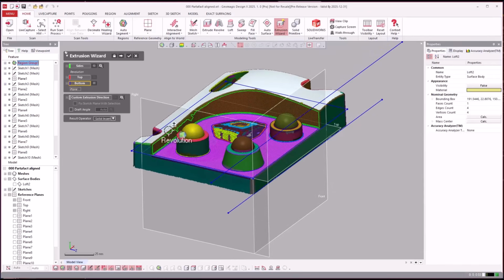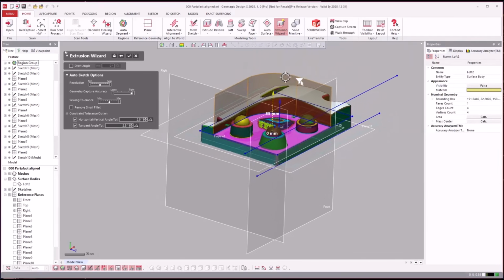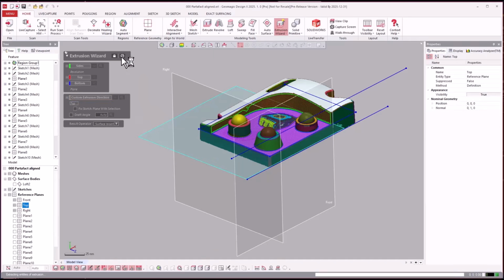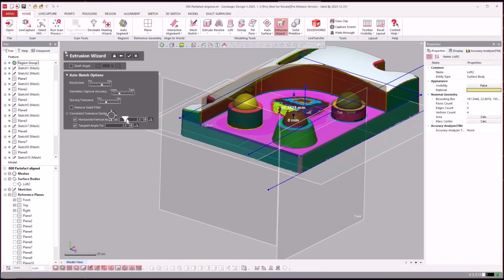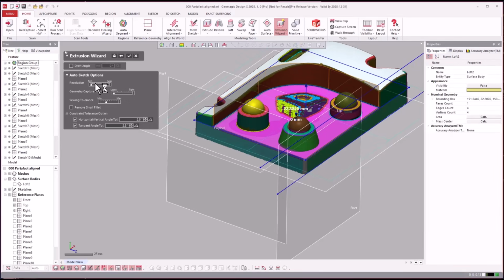So in this instance, because I didn't model the solid part, I just fit that. It's not letting me obviously do the cut. So I can just say, actually, you know what I could do? Surface insert and hit next. There we go. That's more like it. So it's just going to fit that. Now let's go back, and you can say custom direction, make sure it squares it to that plane. And then you see, because it recalculated with a different direction, I can just adjust the resolution, the sewing tolerance, and let it calculate again. Just drag it over. There we go. Hit OK.